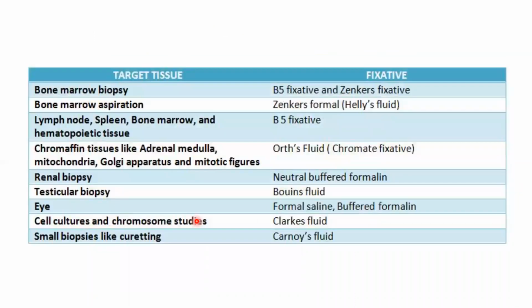Anyway, the first step in immunohistochemistry, which is tissue fixation, is over. Then the second step will be antigen retrieval, a pre-treatment. Upon fixing, even in immunohistochemistry, the proteins are masked. There is a formation of protein crosslinks.